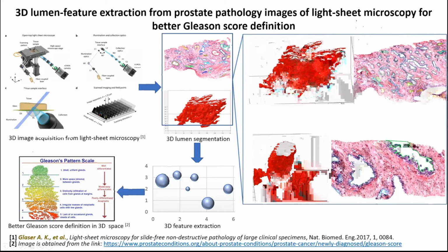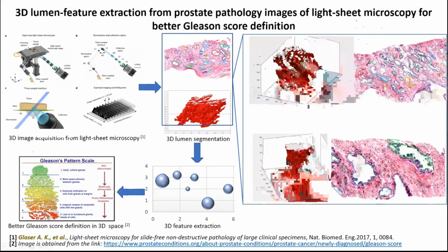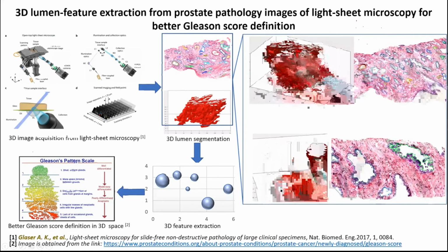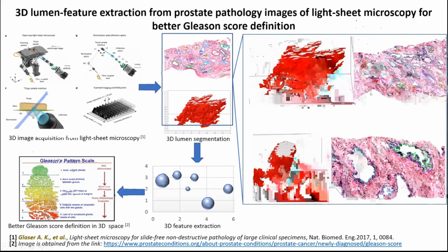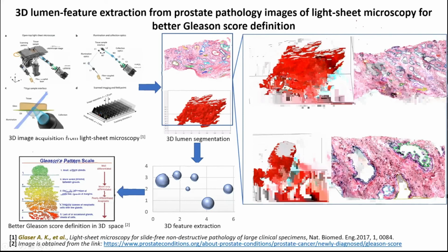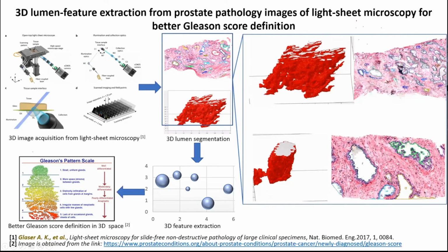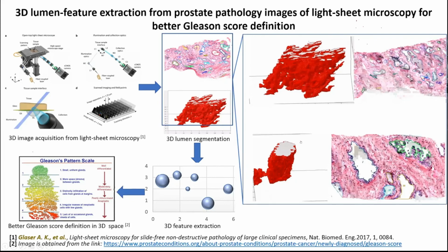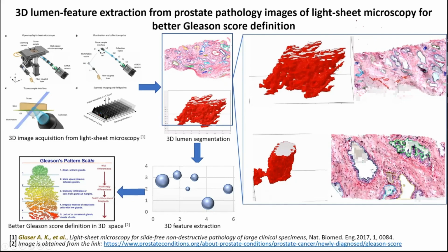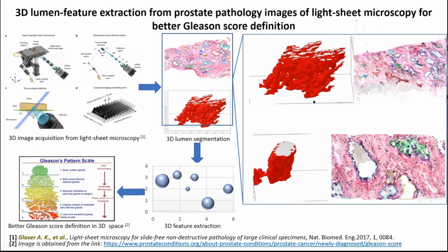This is some of our early data looking at 3D pathomics or 3D approaches to capturing the shape and appearance and arrangement of glands on prostate biopsies. Amazing technology developed by Jonathan and his collaborators, really allowing for a 3D visualization of the structure and the morphology of these biopsies in 3D. I mean, just providing unprecedented views, things that you can't possibly capture in 2D. And so our initial data suggests that the 3D features that we're now trying out from these light sheet microscopy volumes provides a better ability to characterize disease compared to the corresponding features from 2D images alone.